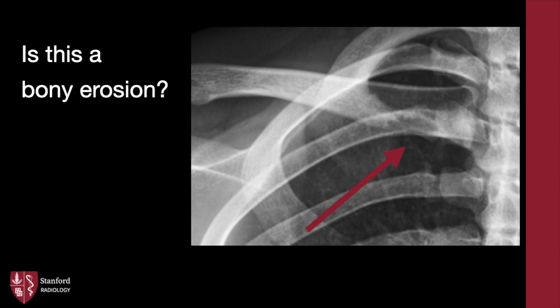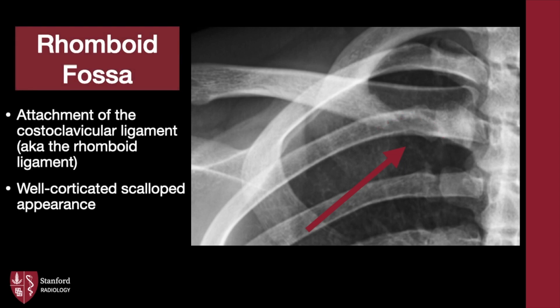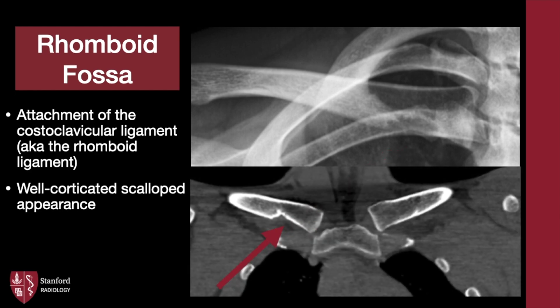First case: is this a bony erosion? The cortical undersurface of the medial clavicle appears irregular. However, note it appears largely well corticated and scalloped. This is the rhomboid fossa, where the costoclavicular or rhomboid ligament attaches. Occasionally, the attachment site has a depressed appearance. Here is a CT companion — note how the variant is not always symmetric.